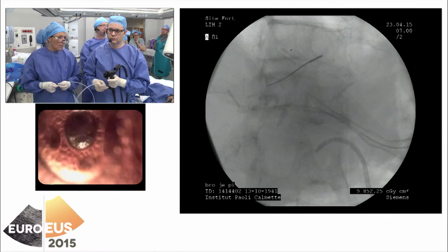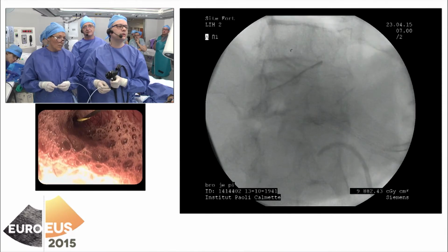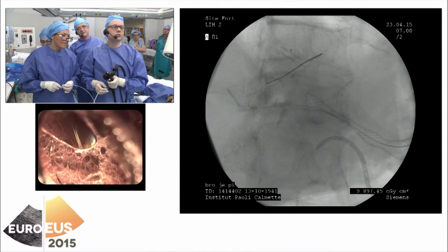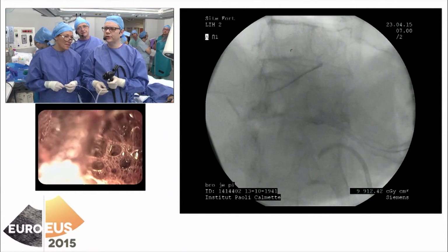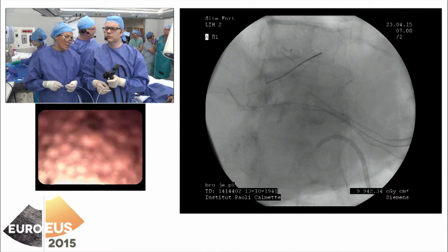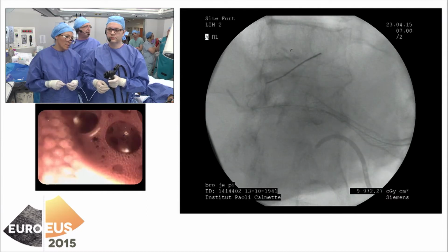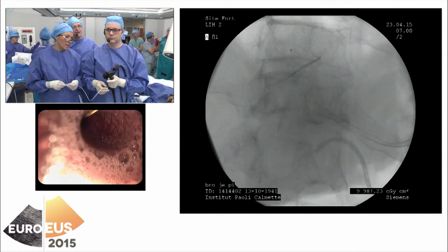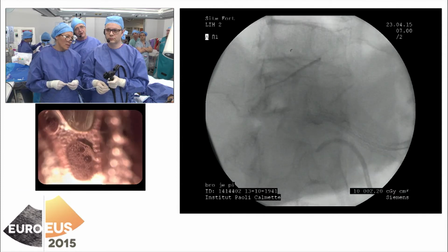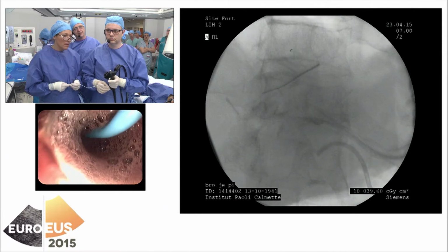Yeah. The stent is efficient. So I push slowly. As Mark mentioned, it's a nice fluoroscopic picture of the bile duct, which is completely empty, including the side branch, which confirms that the size chosen by Erwan was the good one.